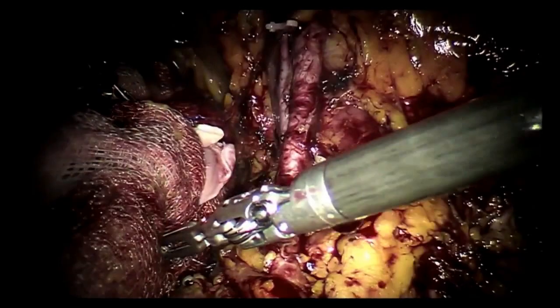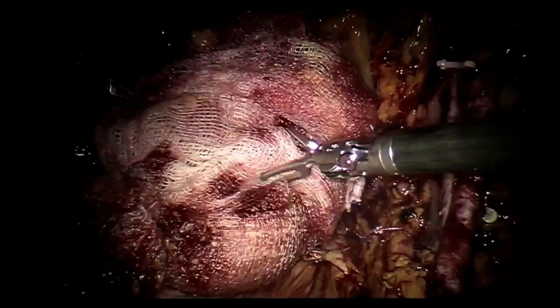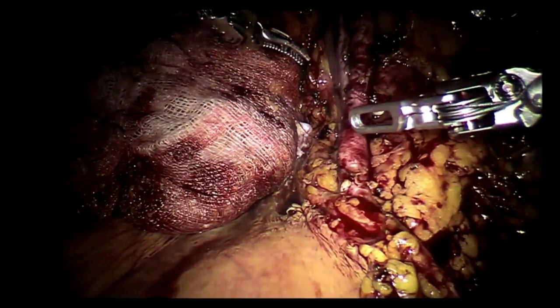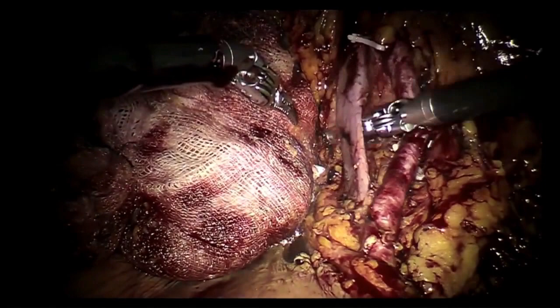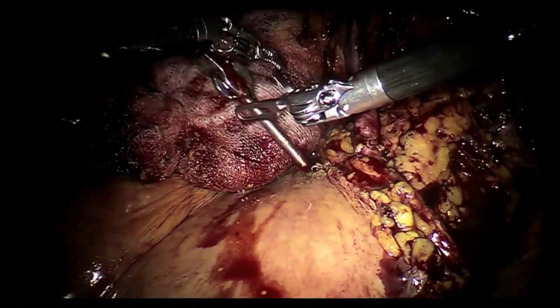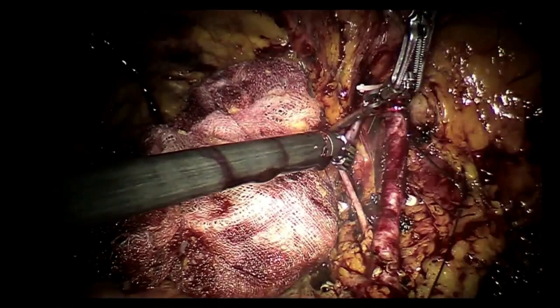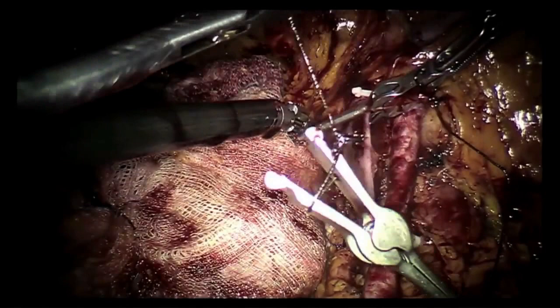Okay, can I have the bulldog clamps now, please? Bulldog clamps, please. Do you heparinize the patients, Dr. Gill? No. Bulldog? Beautiful. One more. That is pneumo. Pneumoperitoneum. Thank you.